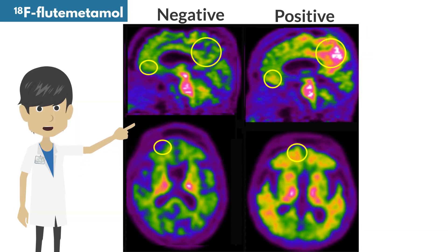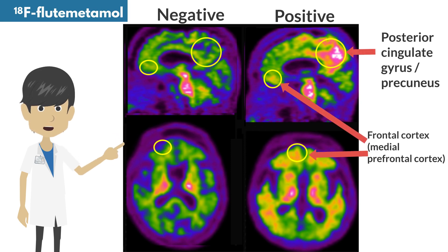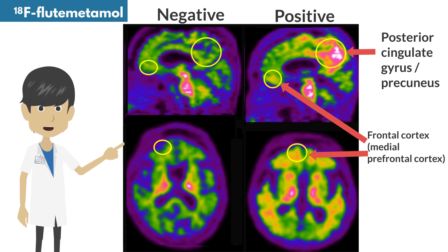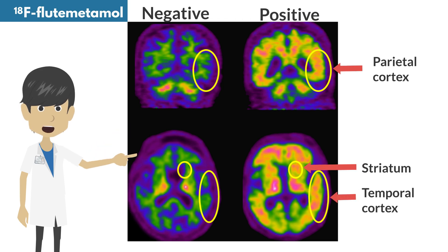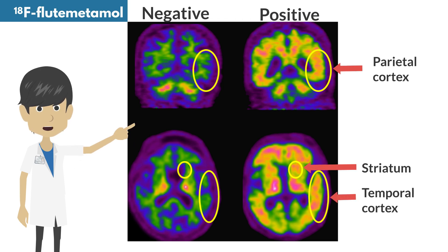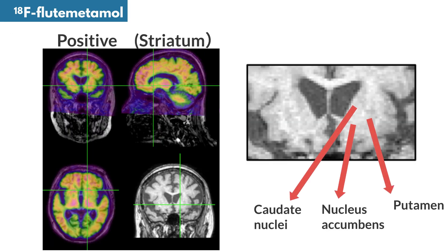Amyloid negative and positive findings in fluorine-18 flutemetamol PET: high accumulation is observed in posterior cingulate gyrus, precuneus, and medial frontal cortex in a positive case. Parietal cortex, temporal cortex, and striatum also show high accumulation in a positive case. Striatal accumulation is located mainly in the anteroventral part of the striatum, including the nucleus accumbens.